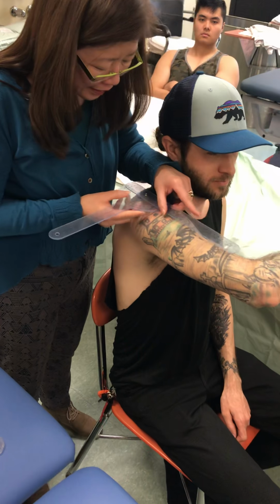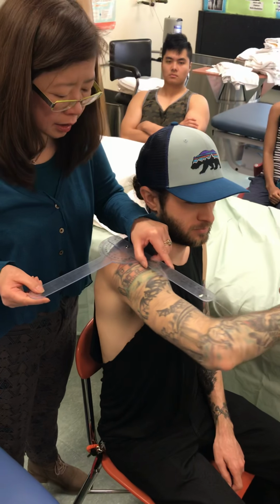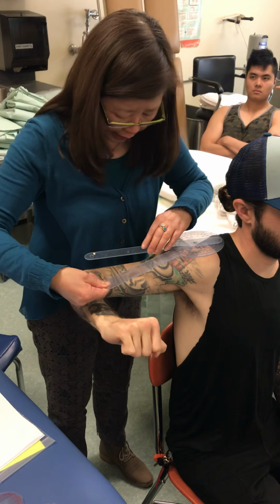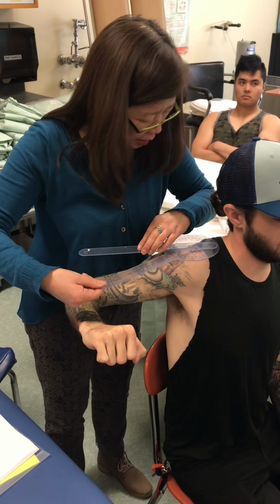Okay. Right. He's still at 0. Can you bring your elbow back as far as you can? Good. Keep going, keep going. As far as you can. Okay, that's it. Alright, hold on. Let me line everything up again.